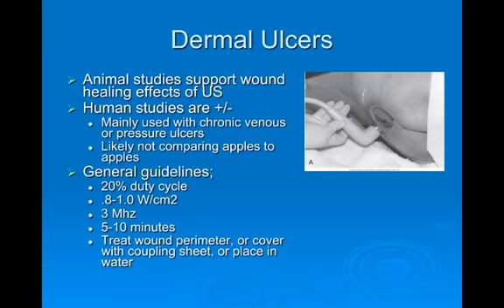Okay, it's also been used for ulcers, and here is where animal studies have been in strong support of the healing effect of ultrasound, but our human studies have not panned out as well.